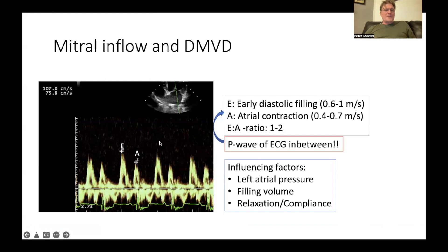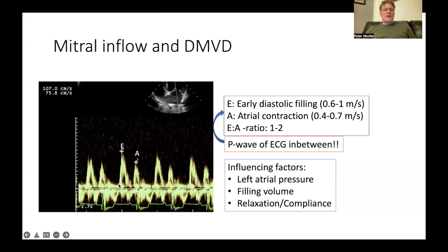In a normal patient, early diastolic filling usually has an amplitude of 0.6 to 1 meter per second. Atrial contraction usually has an amplitude of 0.4 to 0.7 meters per second. The E-to-A ratio is usually 1 to 2 — meaning the E wave is usually taller than the A wave, but not taller than twice the A wave.